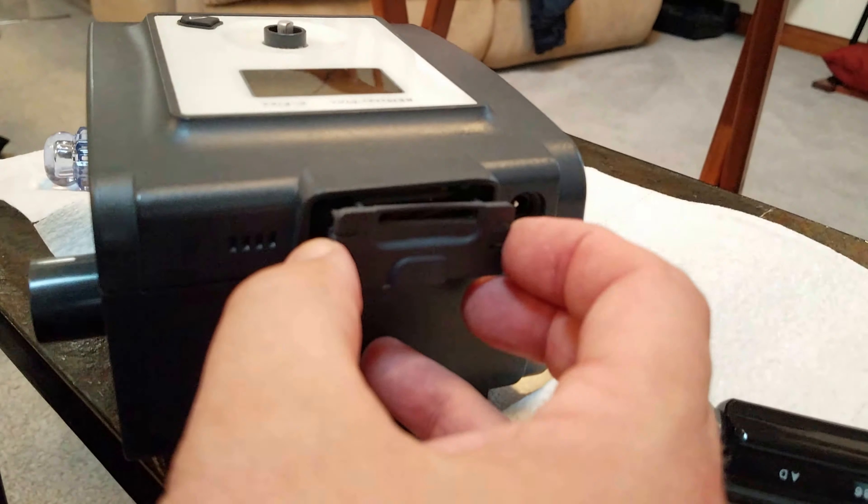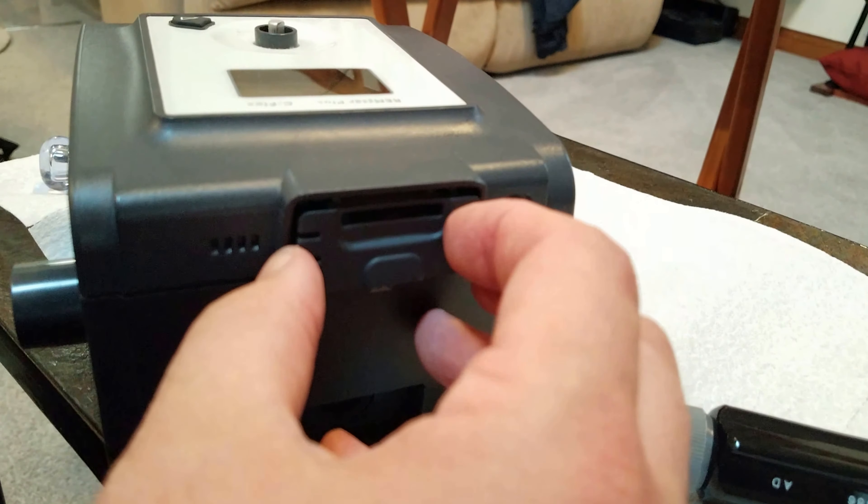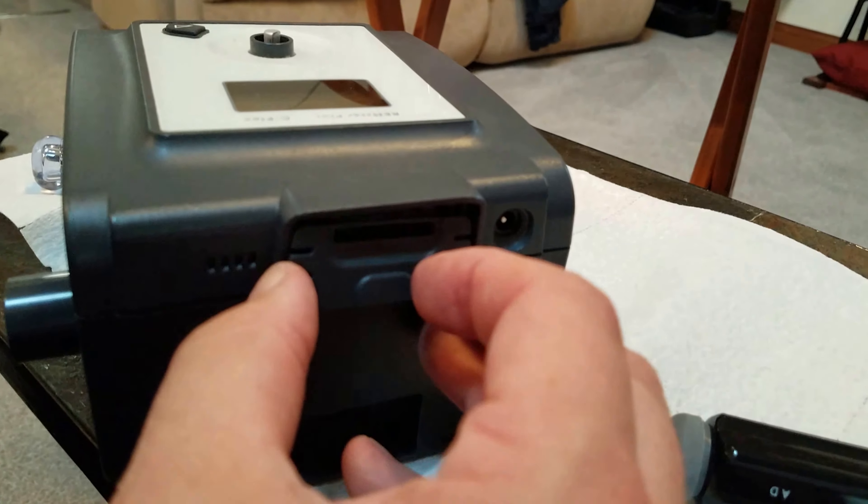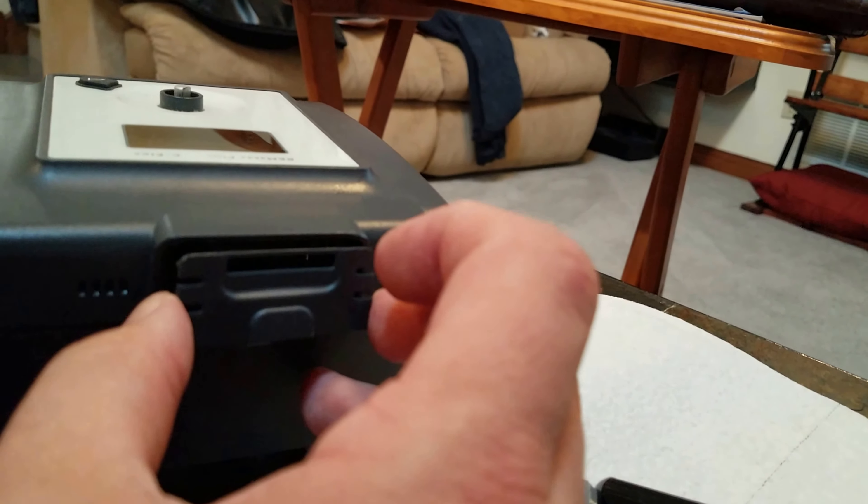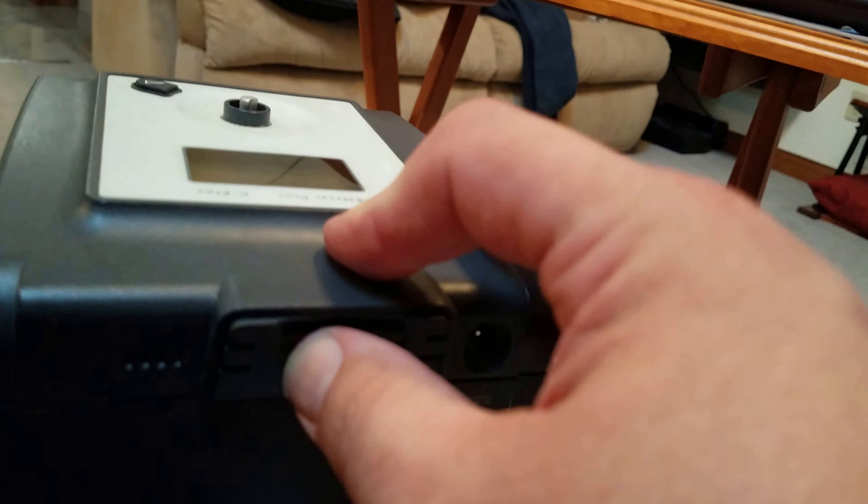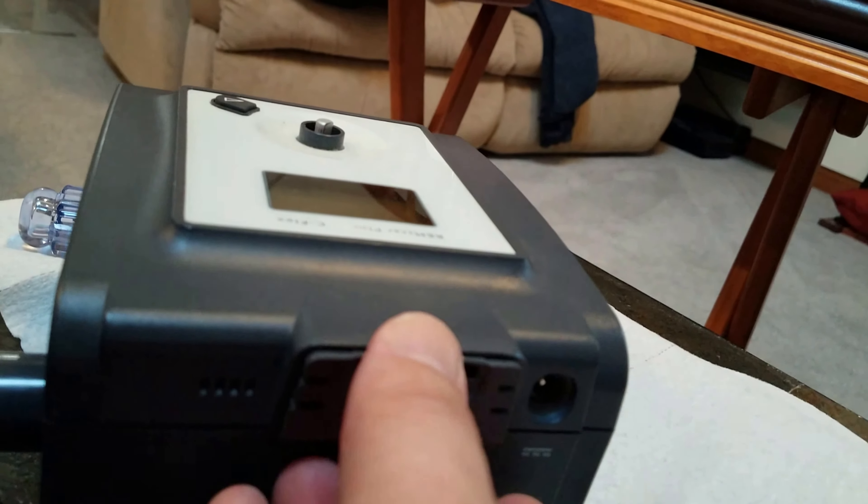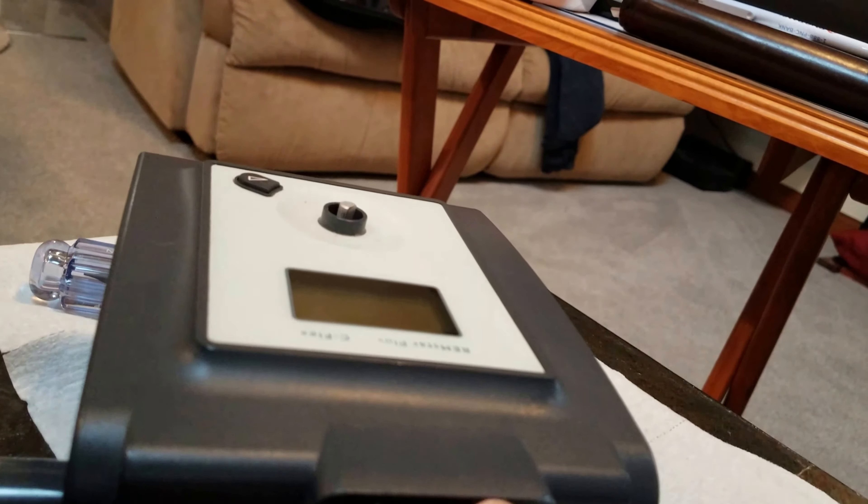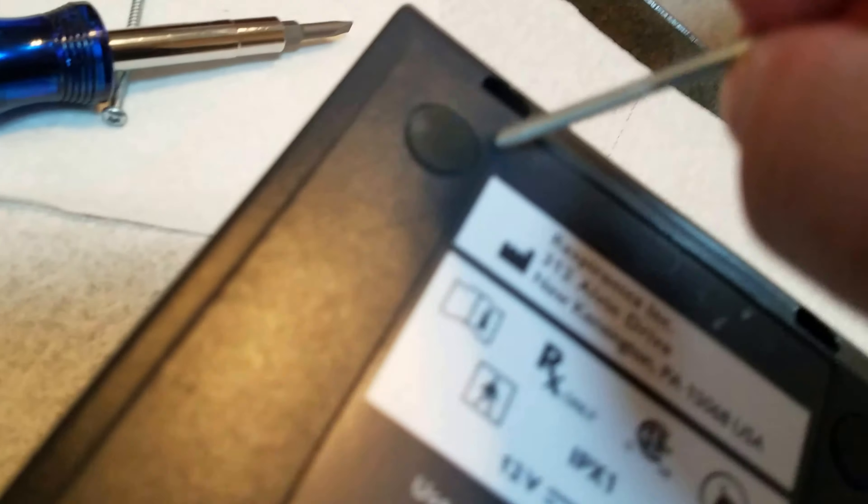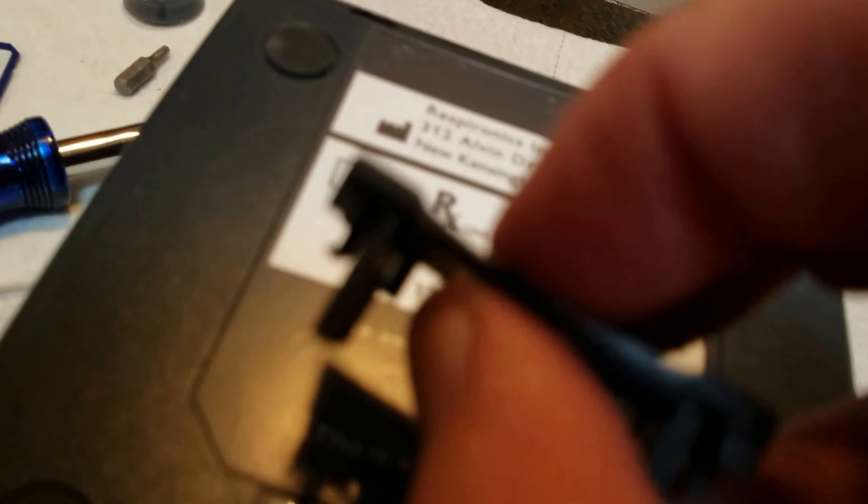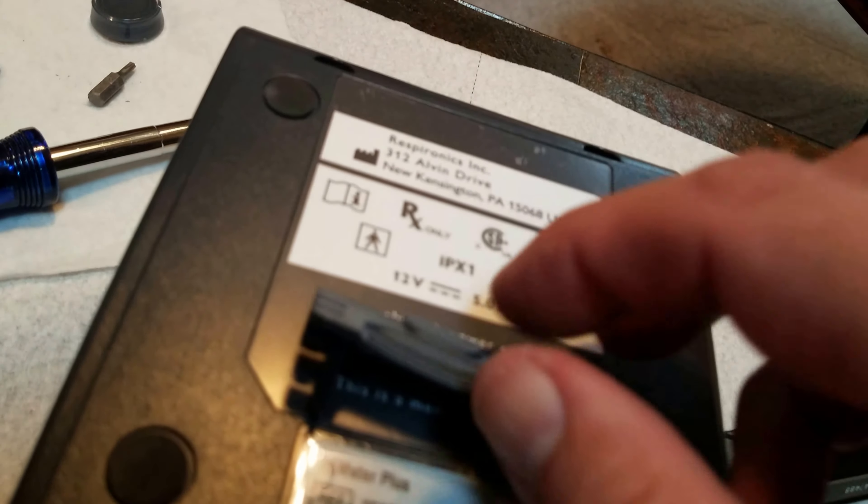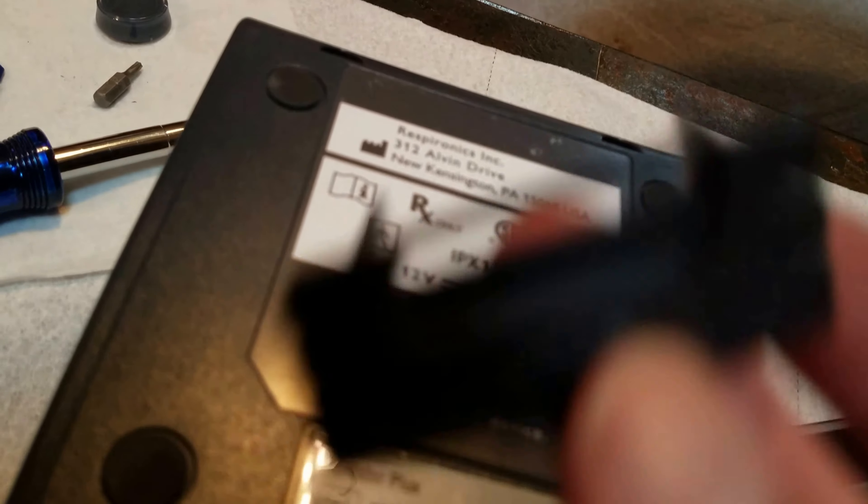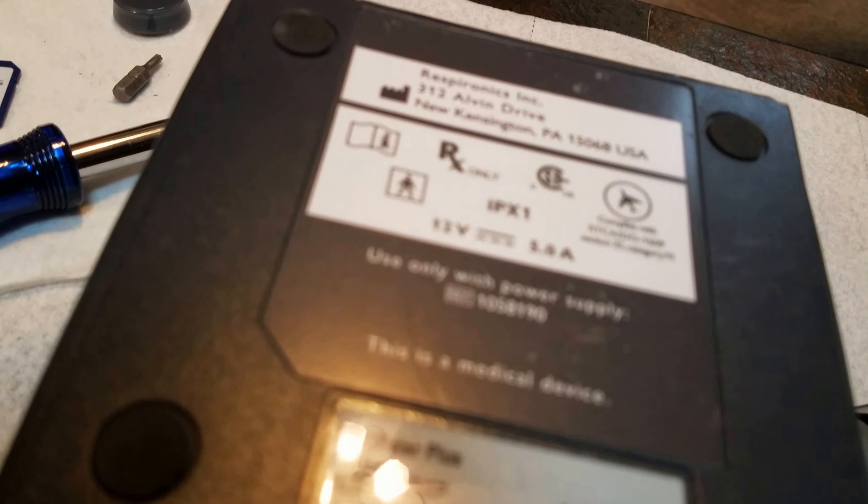I'll get that in in a moment. I don't need to do it right this moment. So flip it over, put the two screws in. Again, this just has a little tab on it if you can see it on both sides, and it just pushes in at the end and clips in.